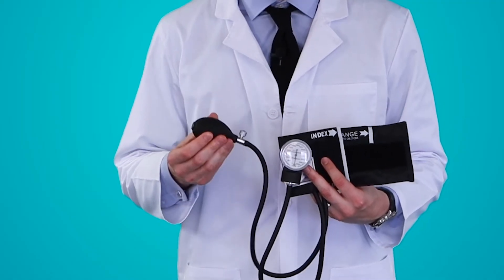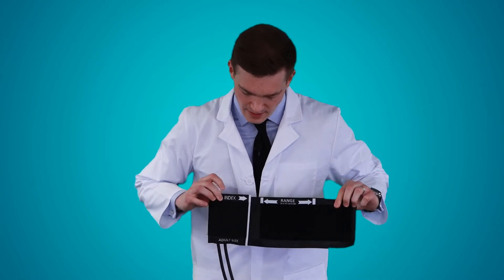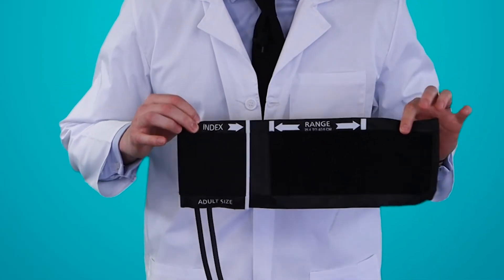It comes with a latex-free inflation system with release valve. It's made of nylon, which is durable, and also has a velcro cuff which is very secure. On the inside it has index and range markings for easy measurements.